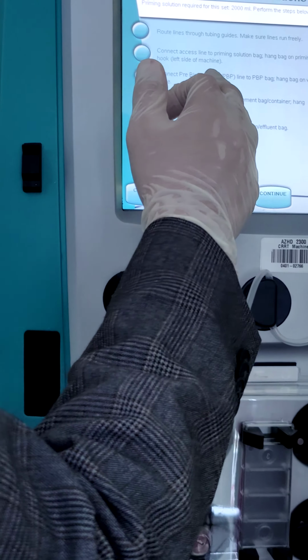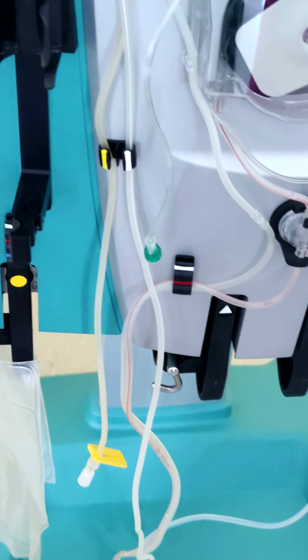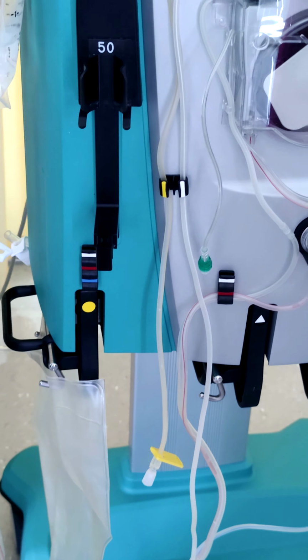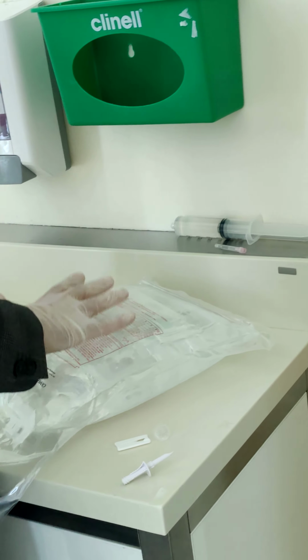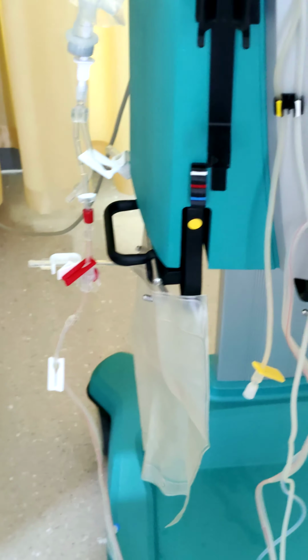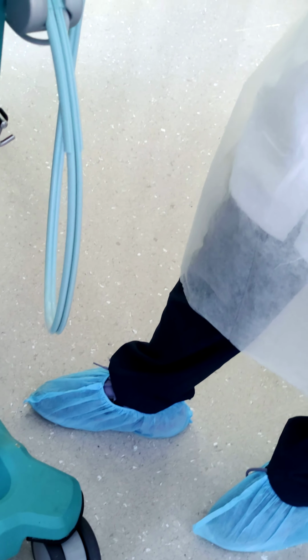Connect the pre blood pump line to the pre blood pump bag, hang the bag on the white scale. If we are planning to use it, we just hang one. We can put only a 500 ml small bag. If you have 500, we can put it. If not, we can use only the line bag. For the pre-blood pump, we will not put any heparin or anything, only saline or whichever solution we need.